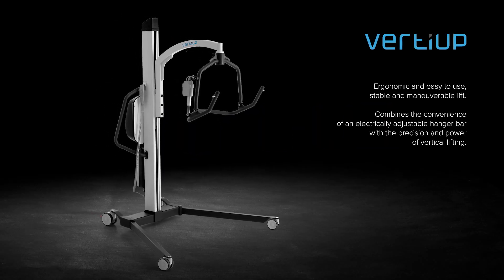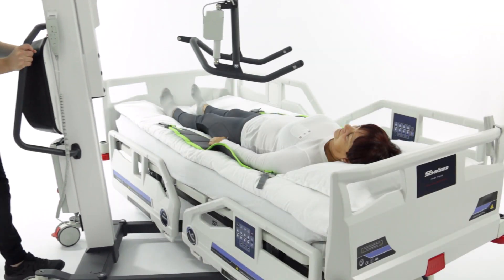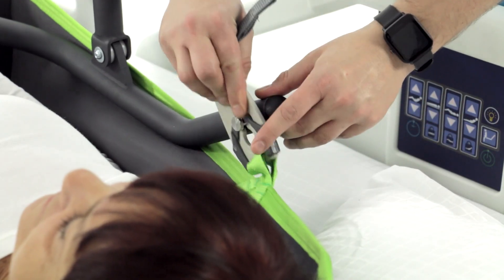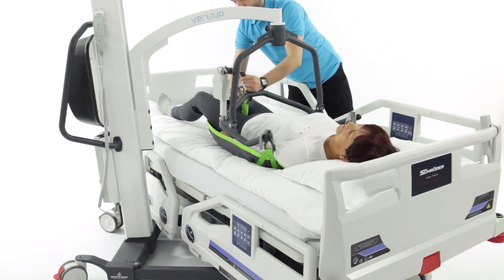VertiUp — ergonomic and easy to use. This stable and maneuverable lift combines the convenience of an electrically adjustable hanger bar with the precision and power of vertical lifting. It has many possibilities and applications.